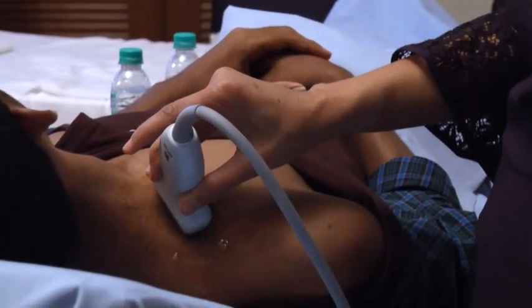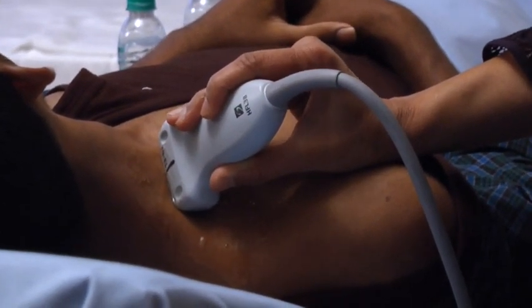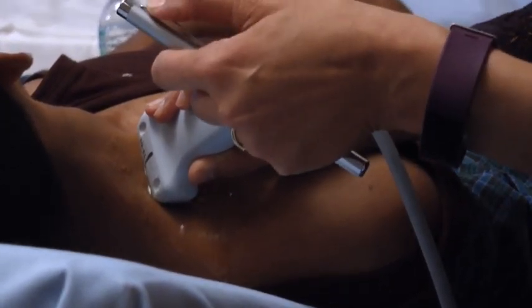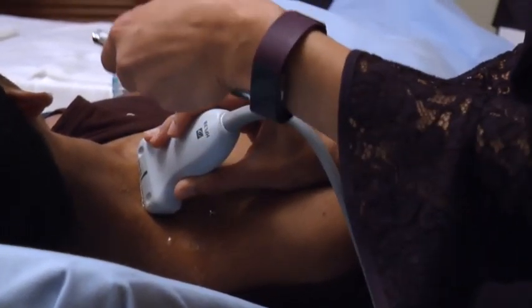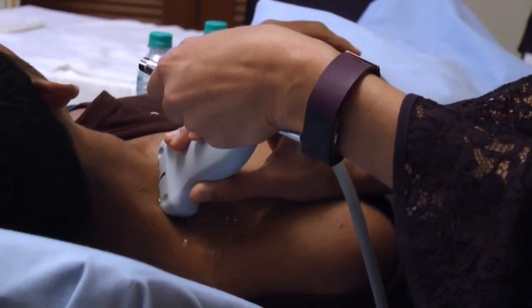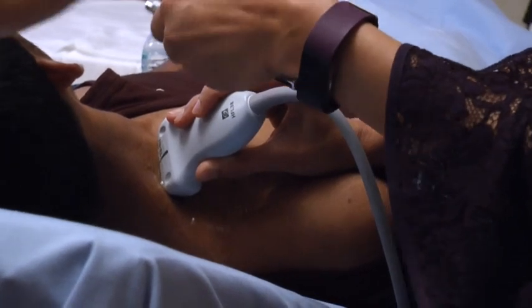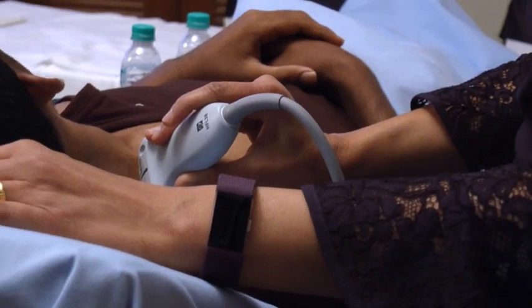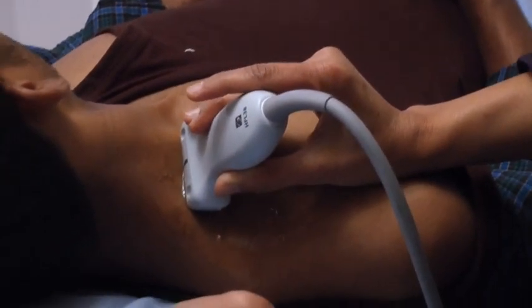So as you scan up in the interscalene groove, you can see the two scalene muscles there. So there we go. Your anterior scalene muscle, your middle scalene. Middle scalene, anterior scalene, and your brachial plexus is sandwiched in between the two scalene muscles.